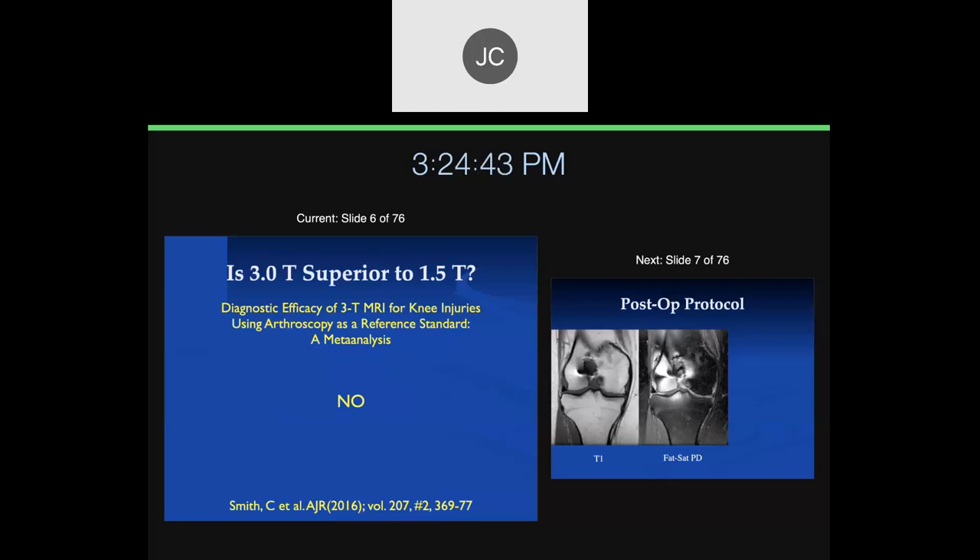There are some more advanced sequences better performed at higher field strength because you get much better signal-to-noise at 3T, such as diffusion imaging and other fancier techniques. But for standard techniques, when 3T was first introduced, people were comparing new 3T scanners to old 1.5T scanners, so they looked better. When the same technology was applied to improve 1.5T scanners, the difference was not that significant.